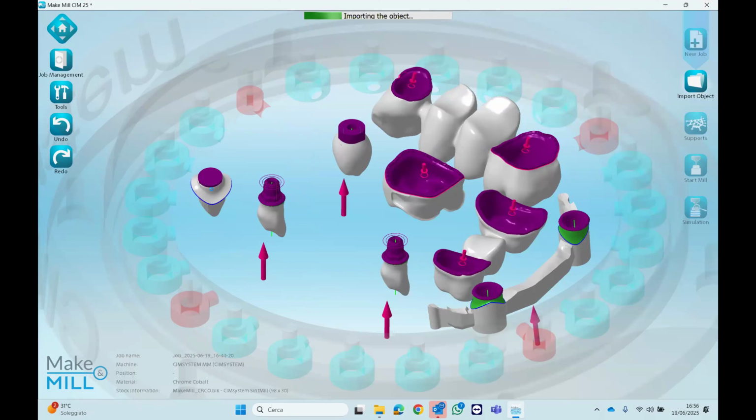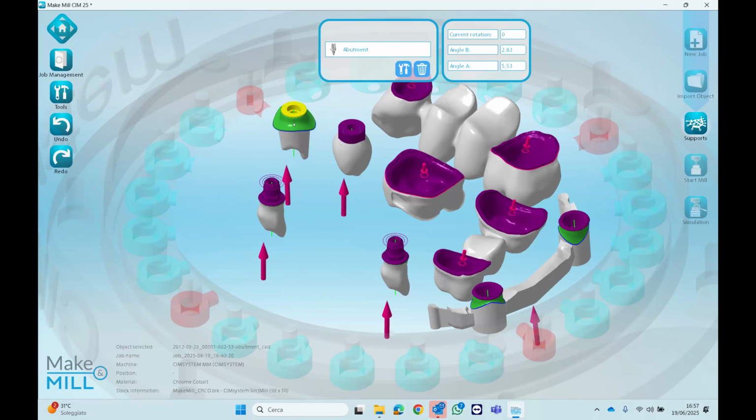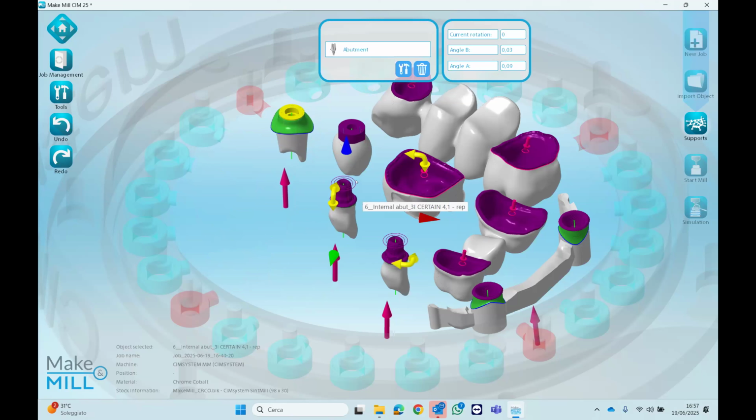Okay. So as you see right here, he imported it and he transformed it in a replace, and here already put the protection cover on it. So now here, what I want to do, I want to position these in another way like this. And I'll put this over here like this. Okay, so once we apply our replace, we can add material. Okay, we already added our material.